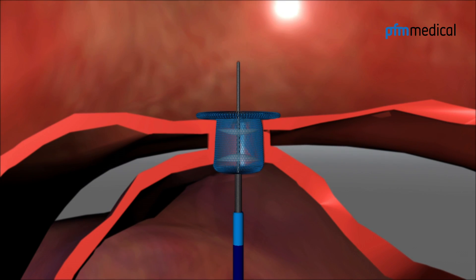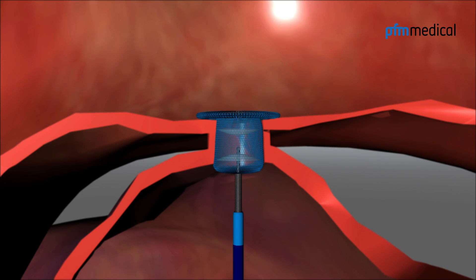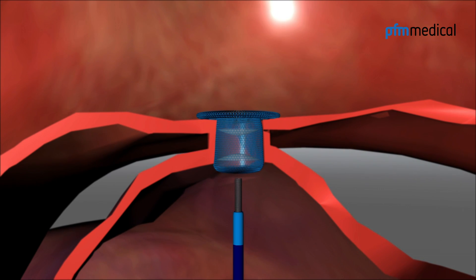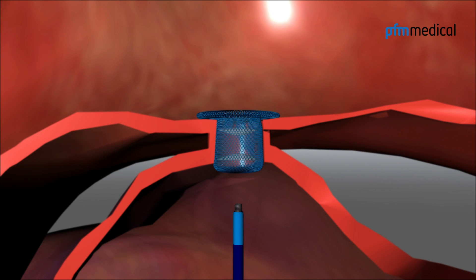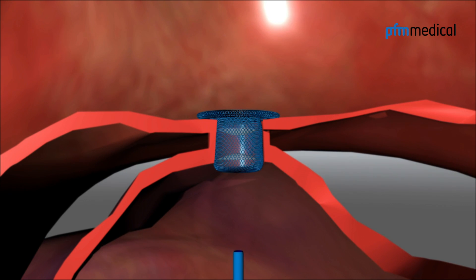For release, the locking wire is retracted. The implantation sheath and delivery system are removed.